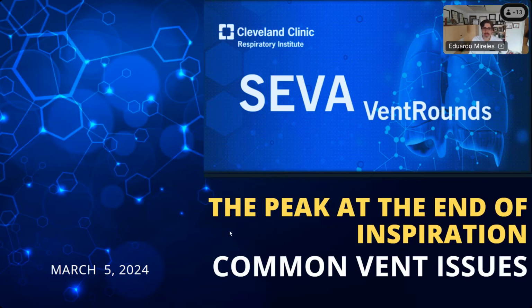Today's topic is the peak at the end of inspiration, and these are common vent issues. We see this a lot. And so I went out today, as I was walking in the unit, and got this case for all of us to discuss. So today is March 5th, 2024.